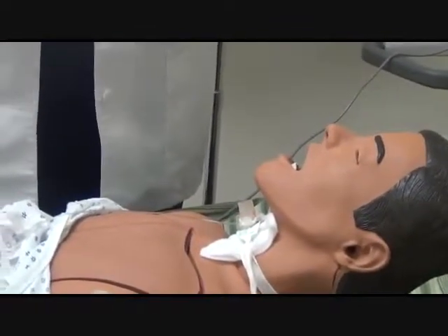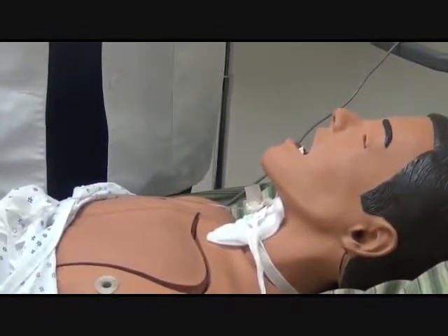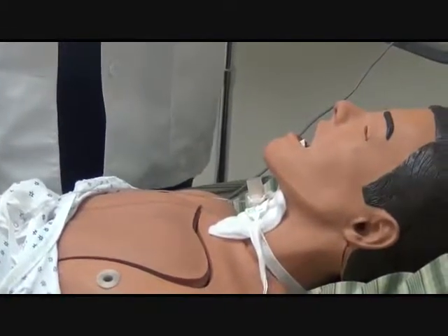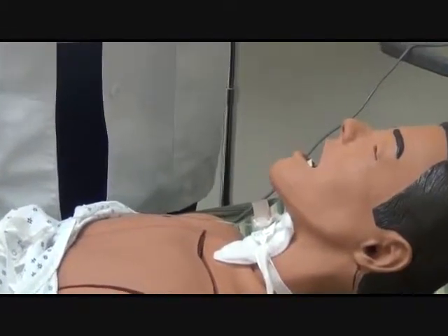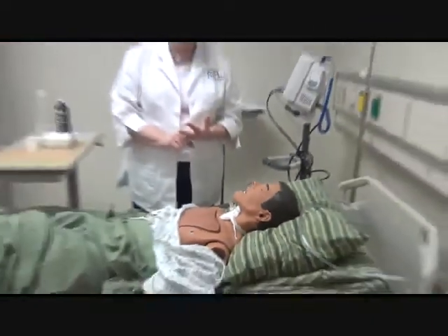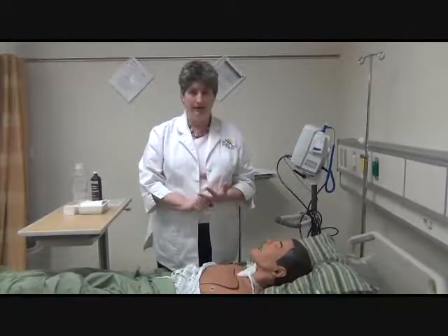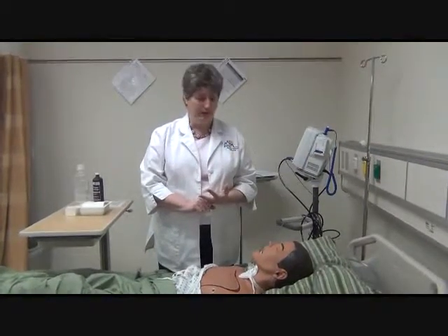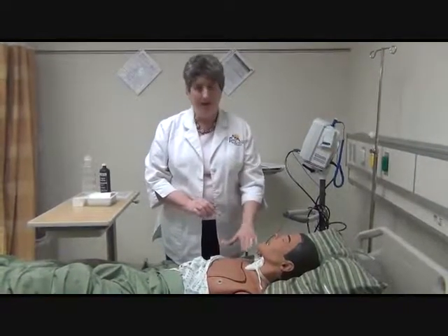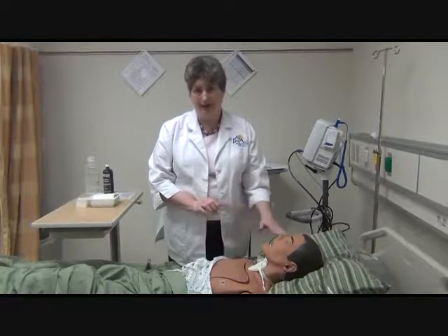A non-fenestrated trach does not have holes in it. This won't be used for a weaning process. A fenestrated trach, the primary cannula that is attached to the appliance or that face plate, has a hole in it that would allow, if we were to put a button on, the patient to talk or, again, breathe in a regular manner.